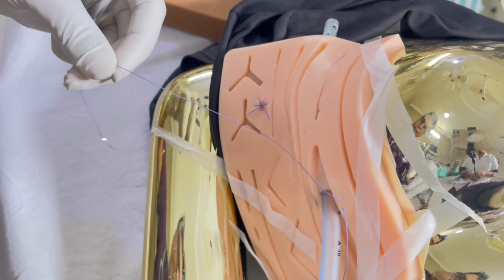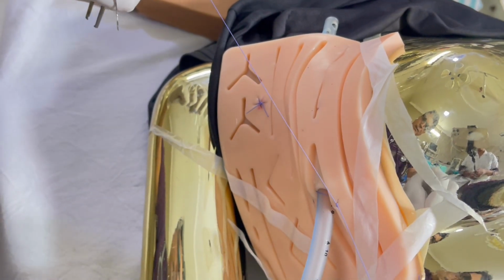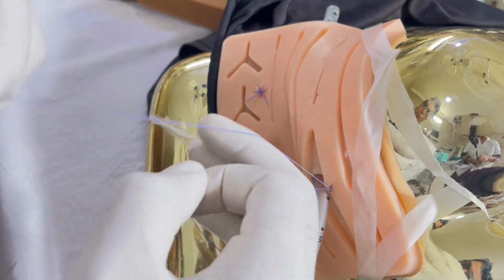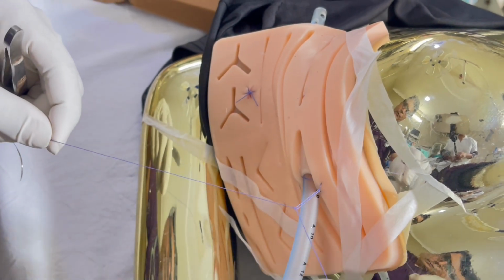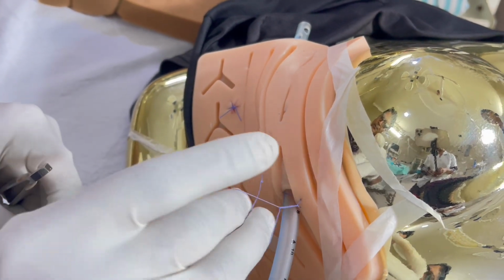So cut the needle and then like it in this manner, so that you can keep it. This is one of the ways.